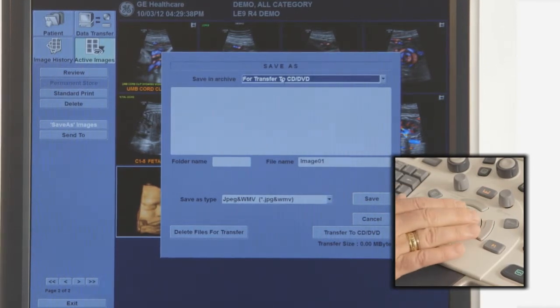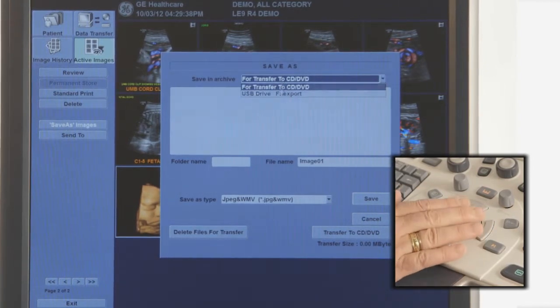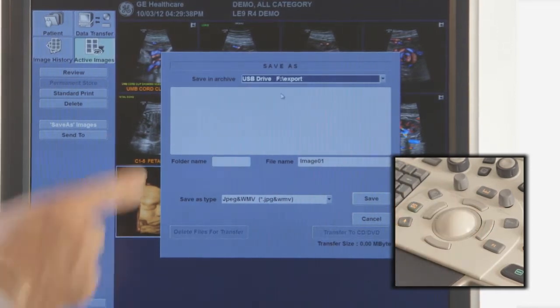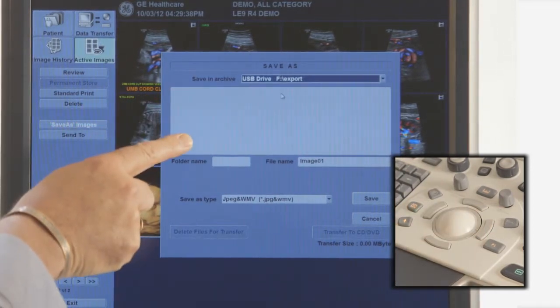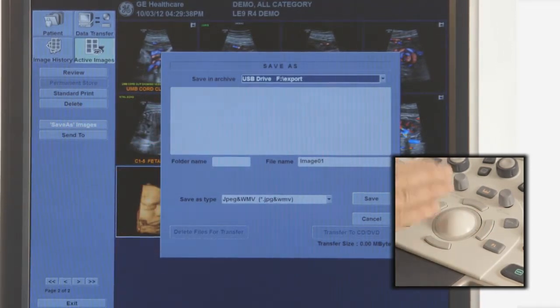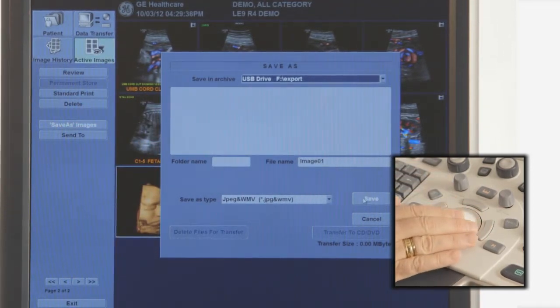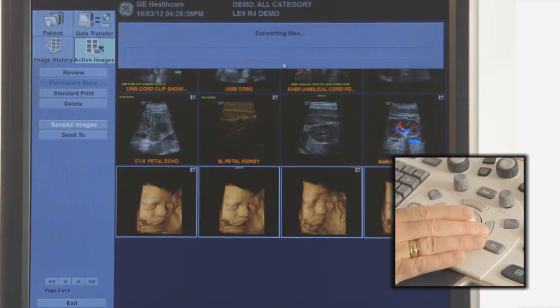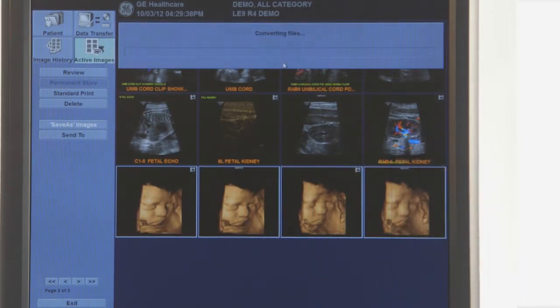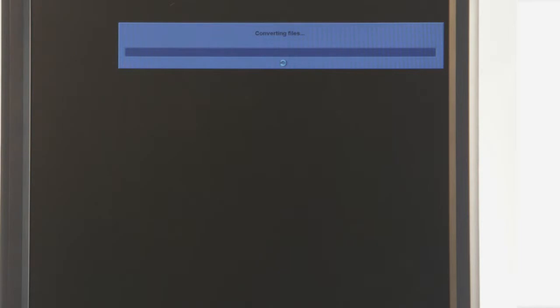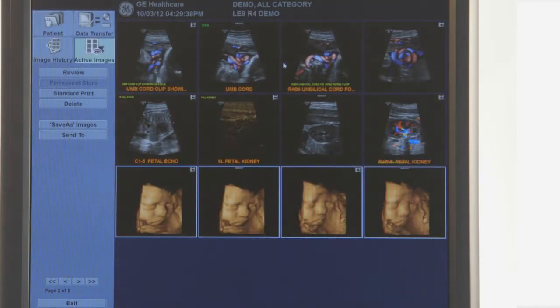Select Save As Images from the left side of the images. Choose the media type on the top of the Save As window. Make sure there are no images in the image buffer and then choose Save. If copying to USB media, you may now eject the drive using the F3 key.